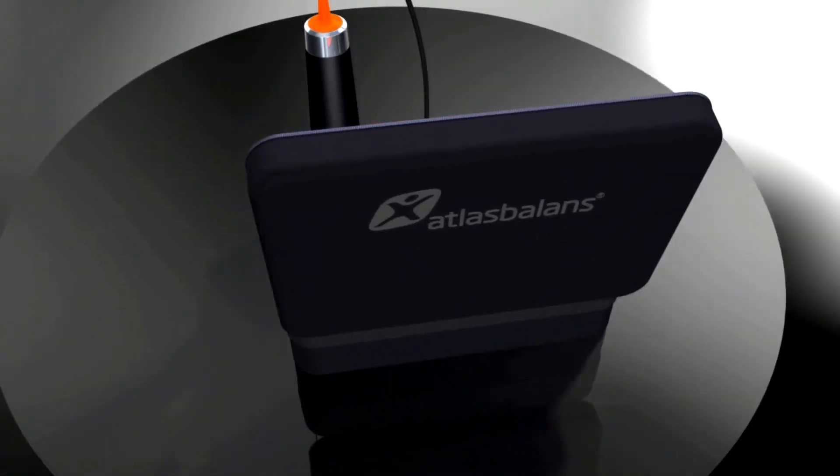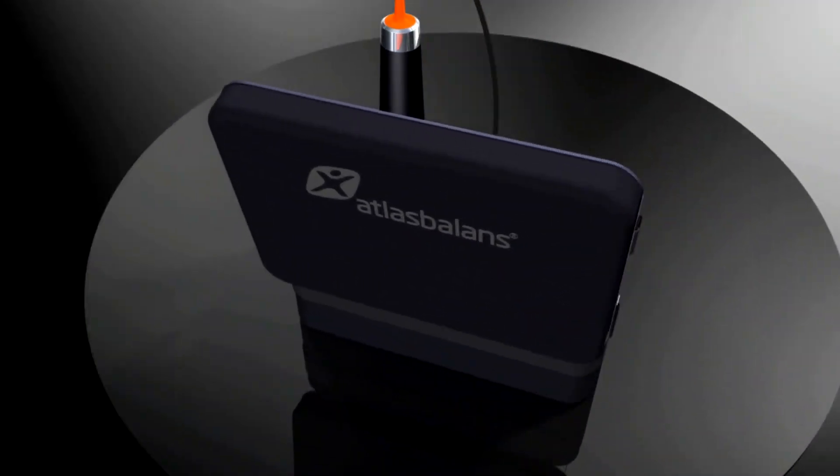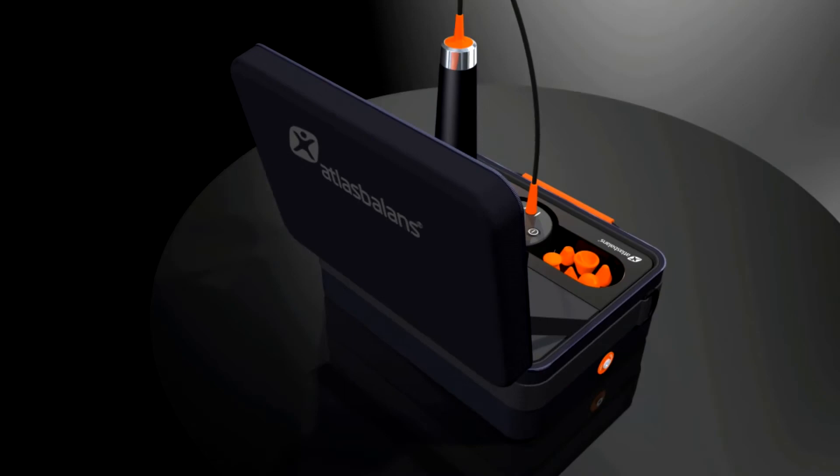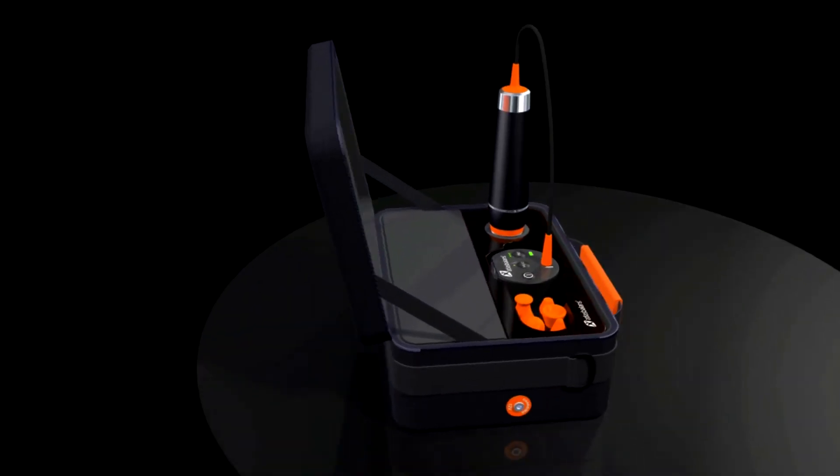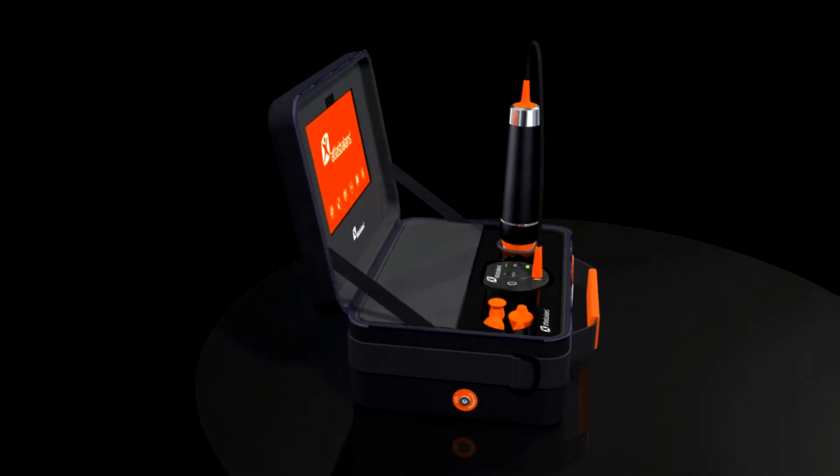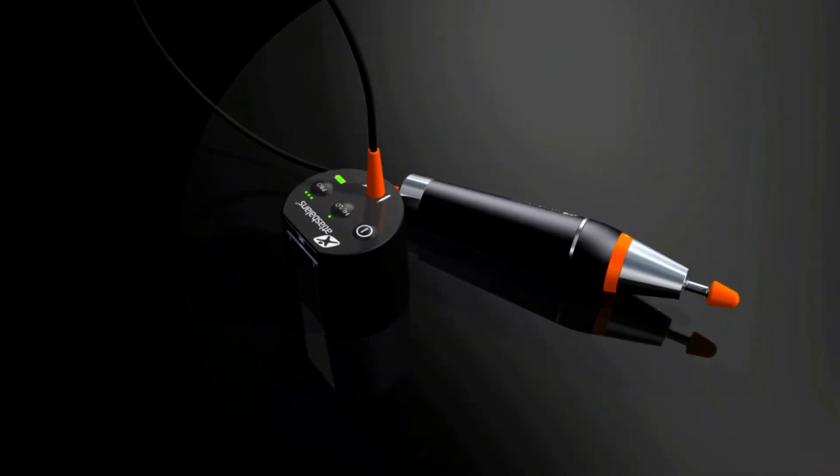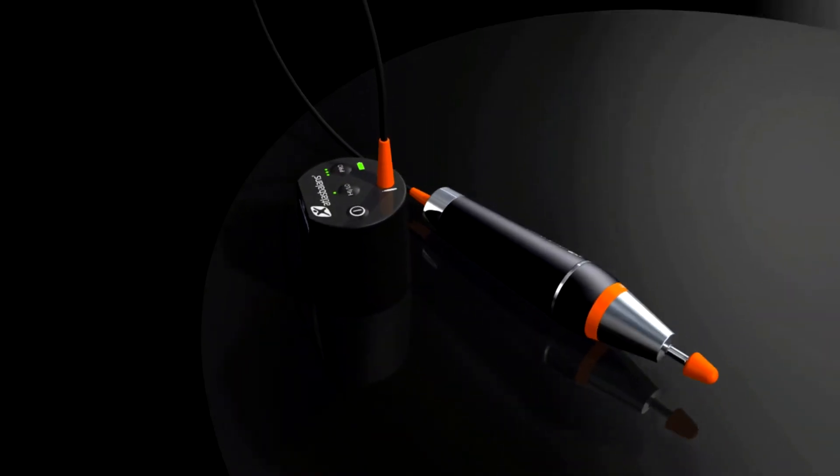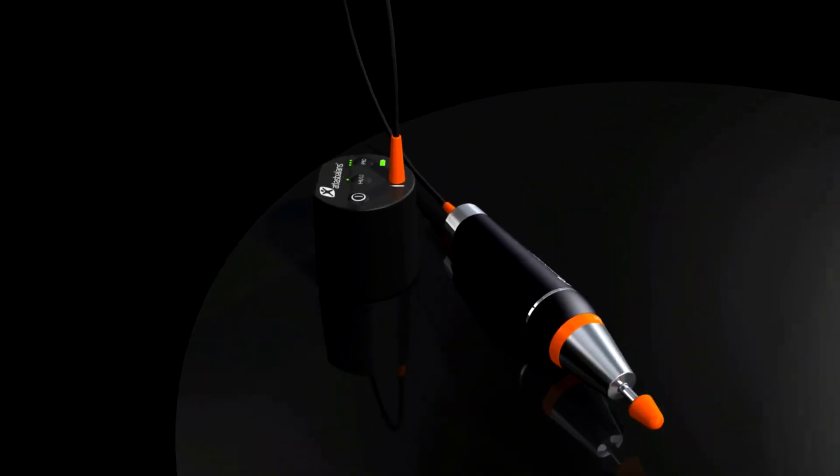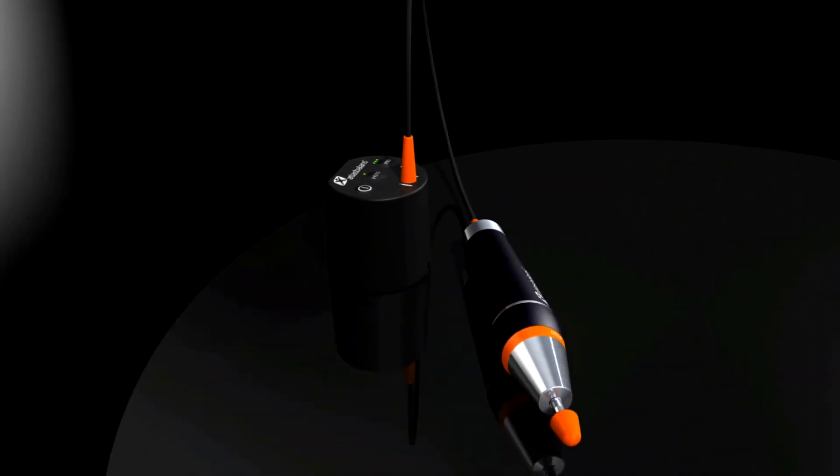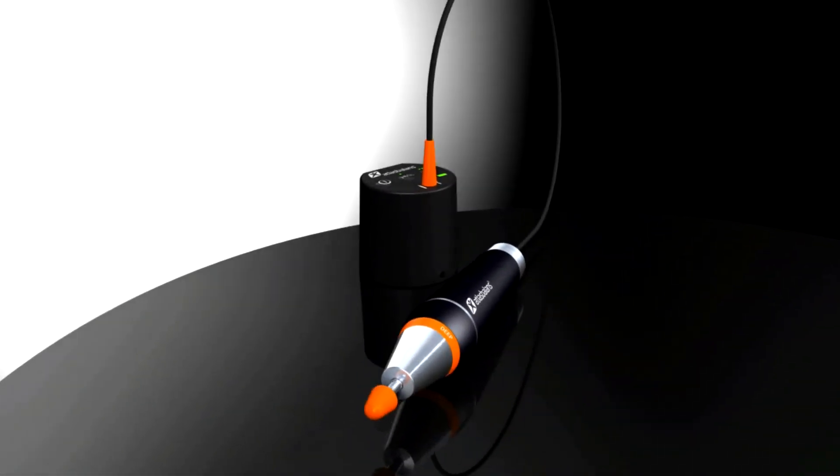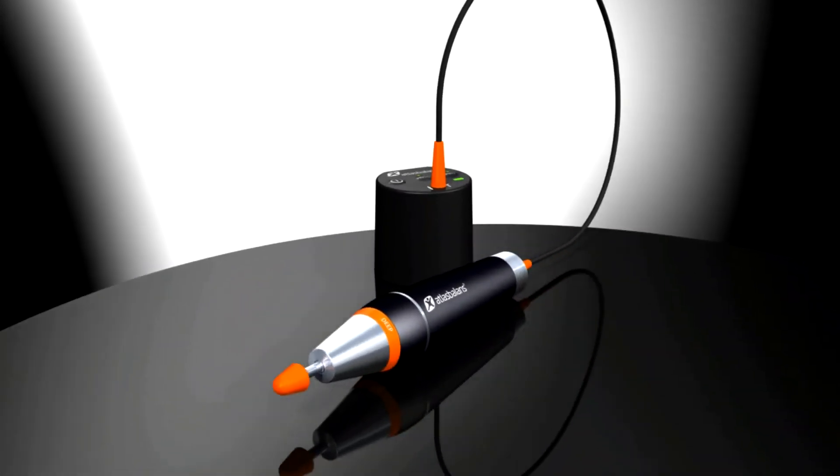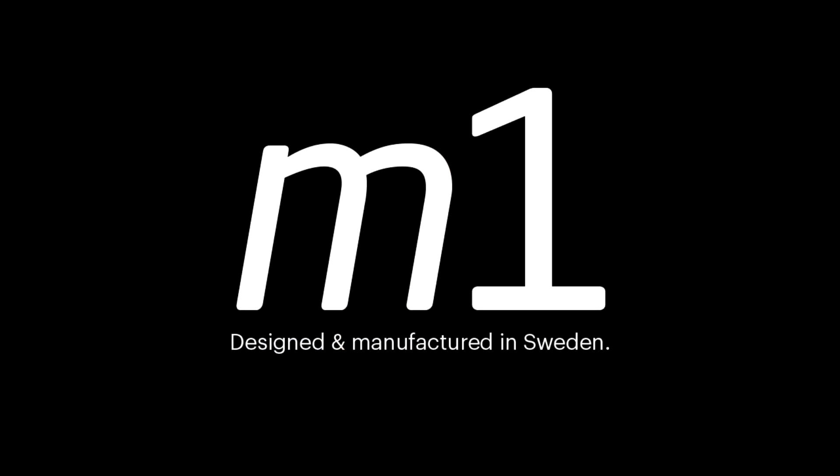The Atlas Balance M1 makes professional therapists even better, helping you achieve results that are very difficult or even impossible to achieve using your hand, and its efficiency reduces treatment time. If you are good with your hands, you will be great with the M1.